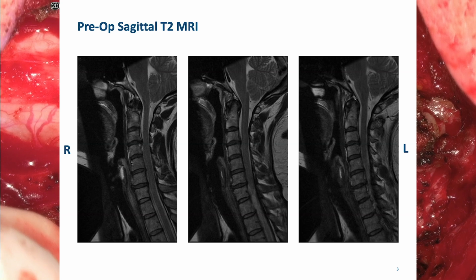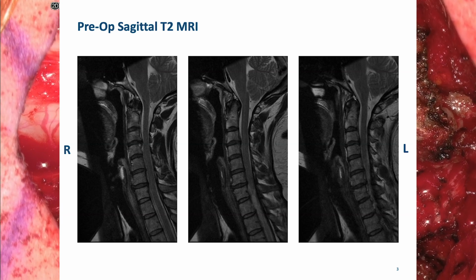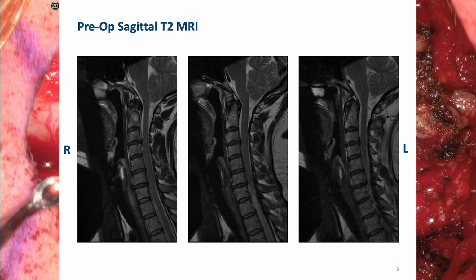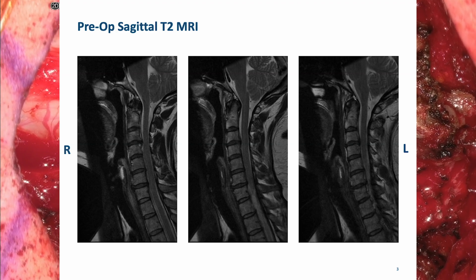Here we have some pre-op sagittal slices of T2 weighted MRI. And here you can see through these different cuts that, one, we can check if there are any pathological changes within the spinal cord, helping us rule out non-compressive pathologies. In this case, we are seeing some compressive pathologies.